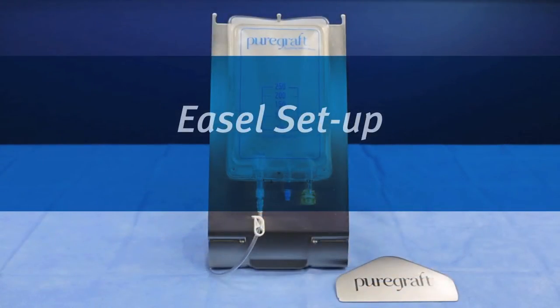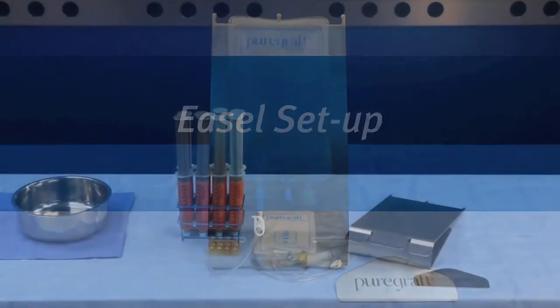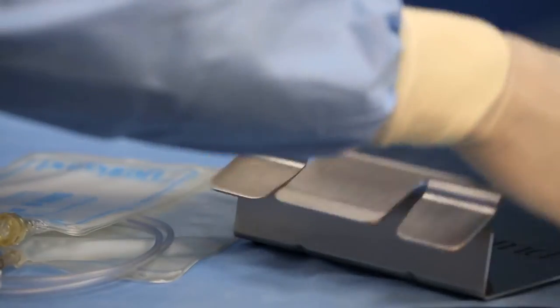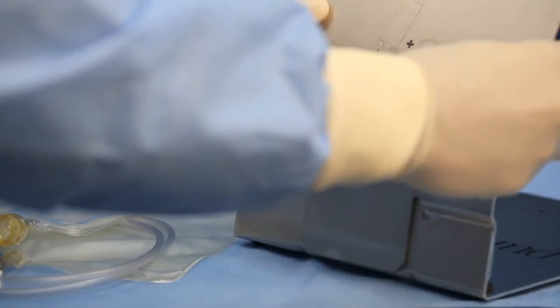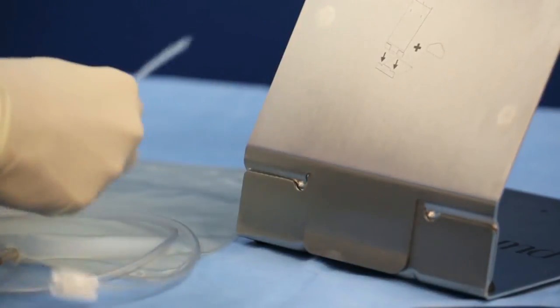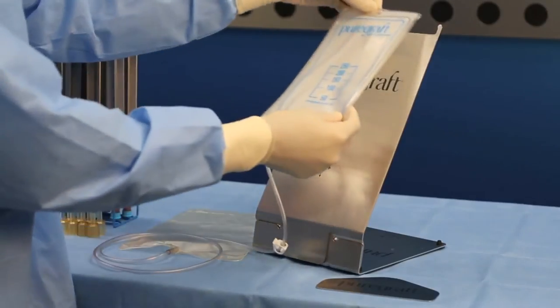Assemble the easel on the sterile field by aligning the grooves and connecting as shown graphically on the easel. Connect the PureGraft 250 to the easel by positioning the hole at the top of the bag into the notch on the easel.